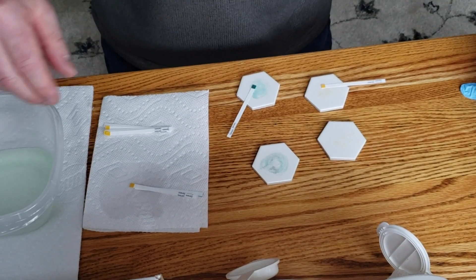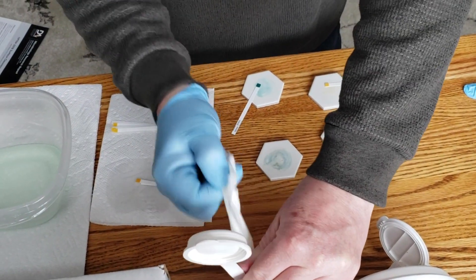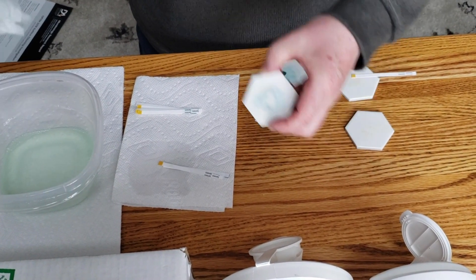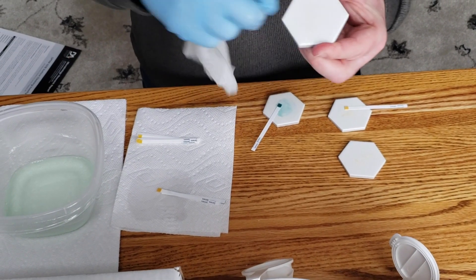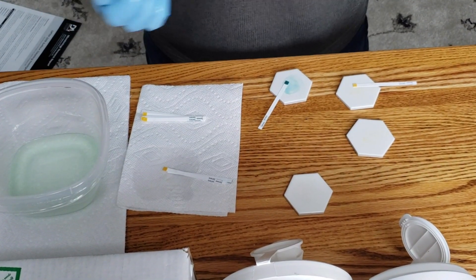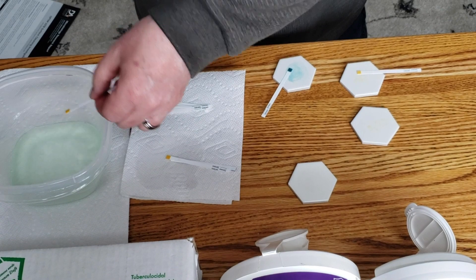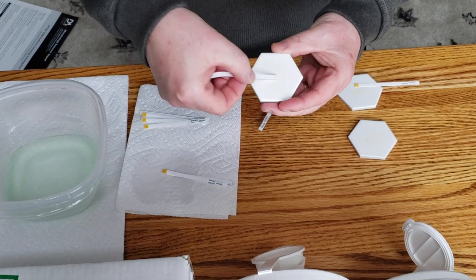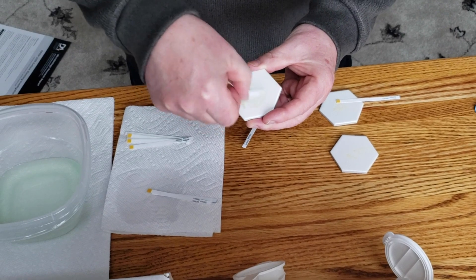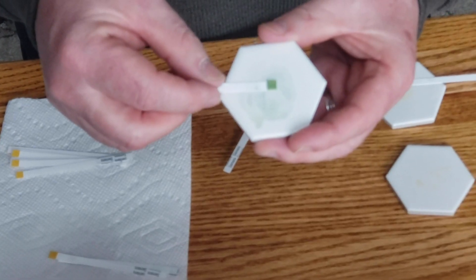Now we'll try a second wipe on that surface with the BioSurf. We'll saturate another wipe and wipe the surface clean, then test the surface again. As you can see, even after the second wipe, there's still quite a bit of residual blood on the surface. Thank you.